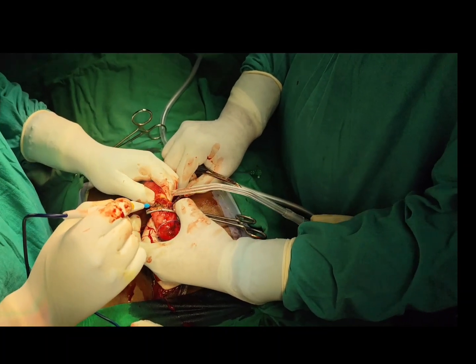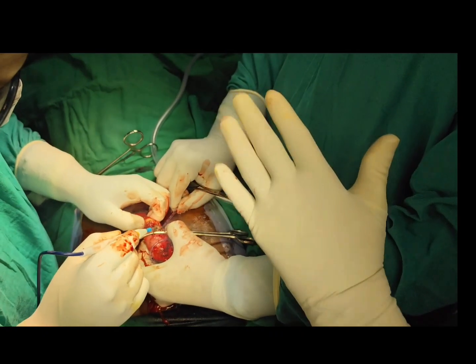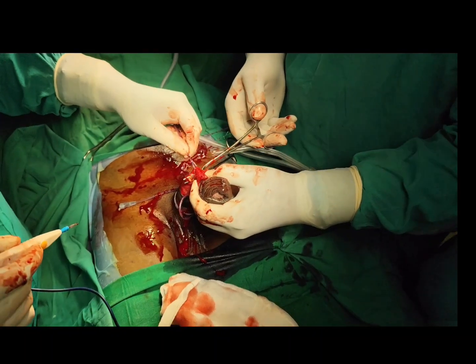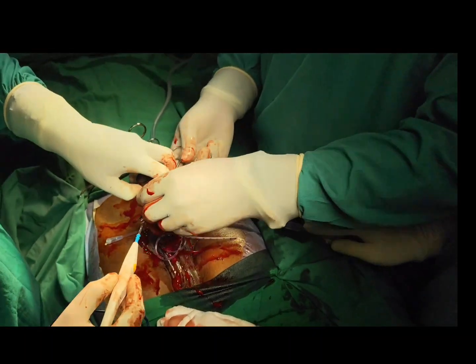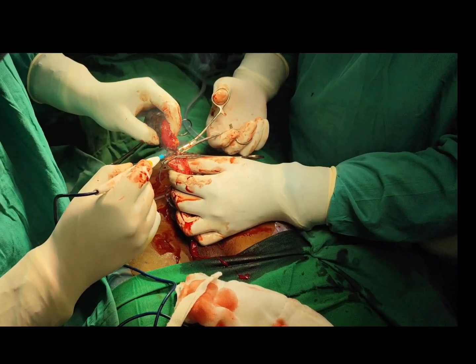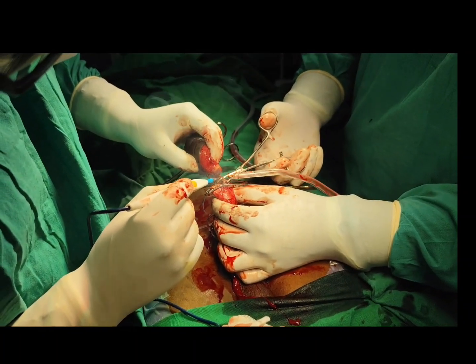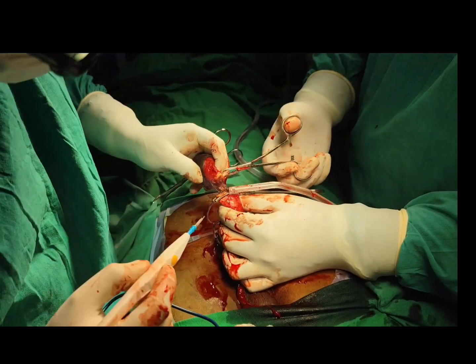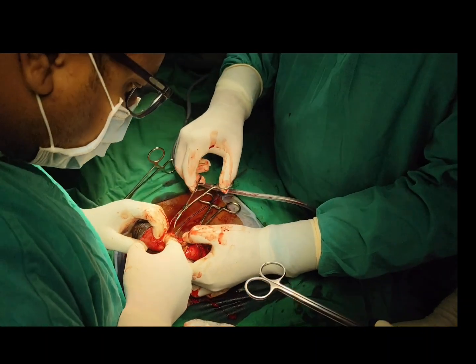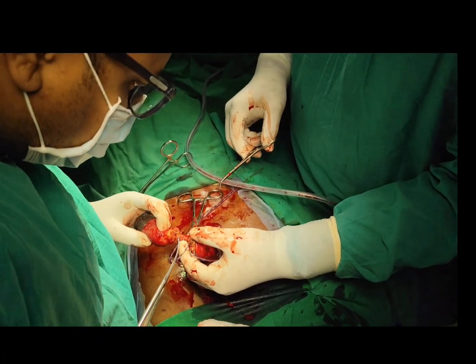So we are cauterizing the corpus cavernosa now. So here we can see the corpus spongiosa that was preserved for this patient. So we have completely separated the corpus cavernosa now, and this part will be sent for histopathological examination for margins.